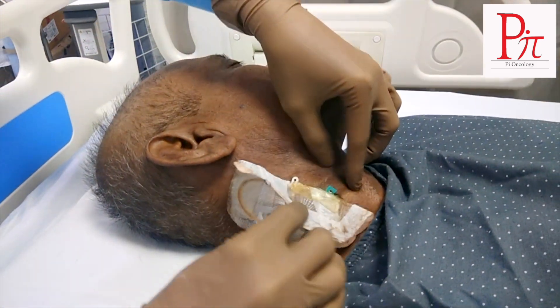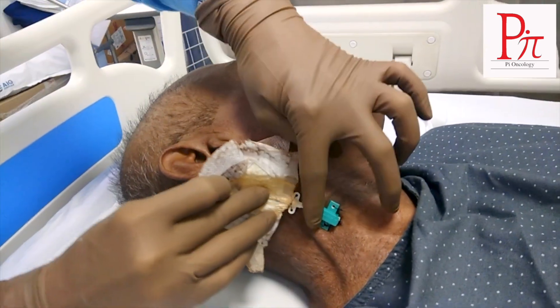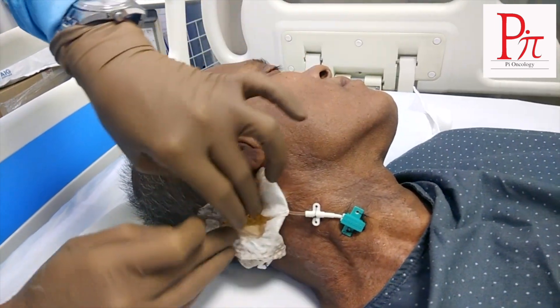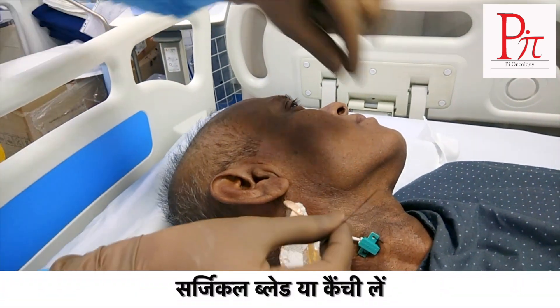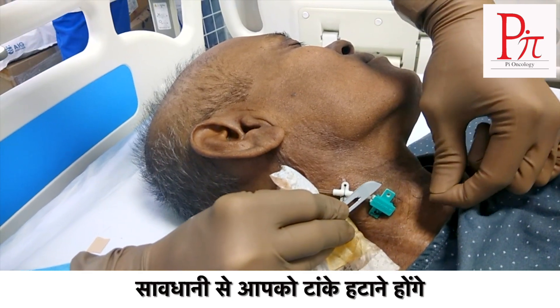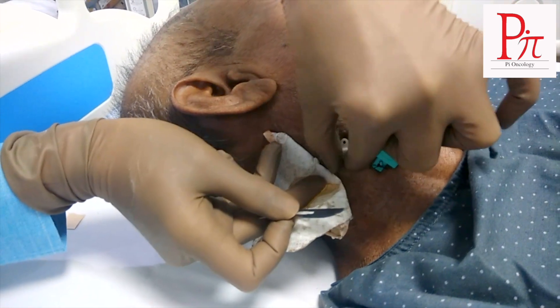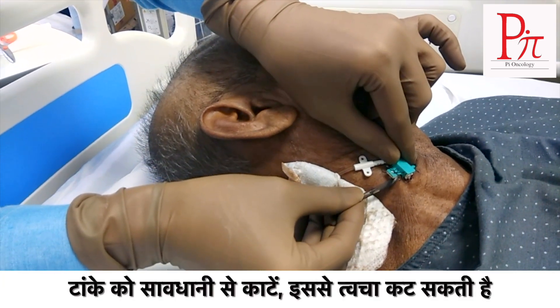Just give me a scalpel blade. You can see that there are sutures here, so take any of the surgical blades or suture cutting scissors. With care, you have to remove the sutures without cutting the skin. Similarly, other sutures you have to cut and remove. Take care not to cut the skin, otherwise it will be bleeding.